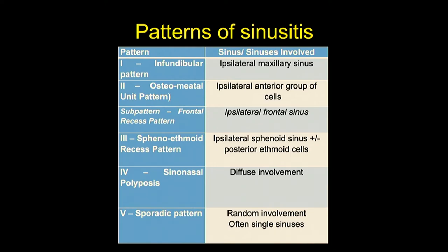Pattern 1 is the infundibular pattern. The infundibulum drains the maxillary sinus and the ethmoid sinuses, so when the infundibulum is obstructed, the sinuses involved are the ipsilateral maxillary sinus and the anterior ethmoidal group. Pattern 2 is the osteomeatal unit pattern, which will obstruct all the anterior group of sinuses, giving disease in the frontal, anterior ethmoidal, and maxillary sinuses.